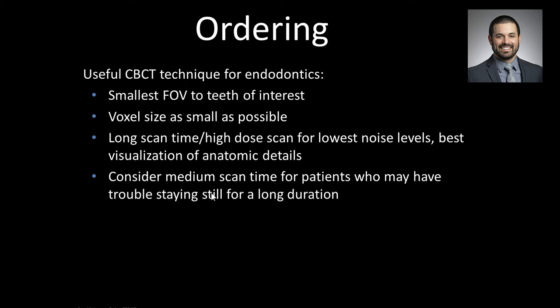If you have a patient that has trouble staying still for that, for example, long 30-second scan, you might elect for the medium scan time. If they can stay still for 15 seconds, but not 30 seconds, you're going to come out ahead by avoiding motion artifact with that 15-second scan, despite a slight noise and image quality penalty.